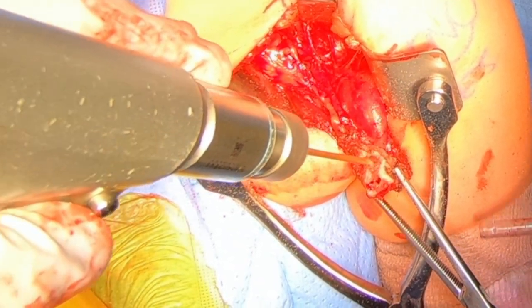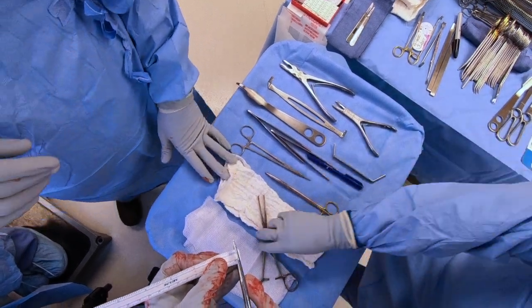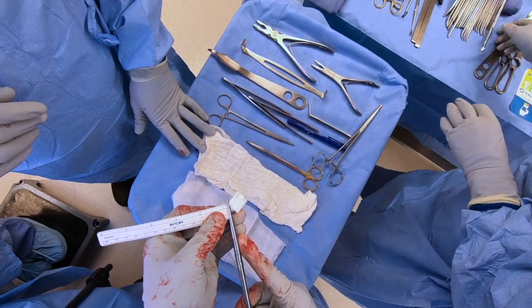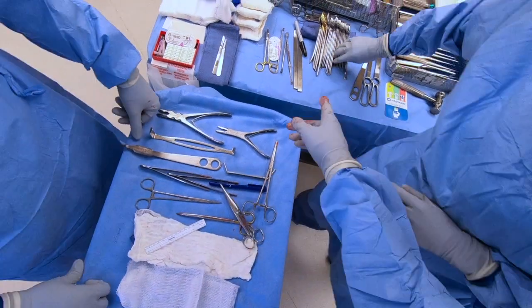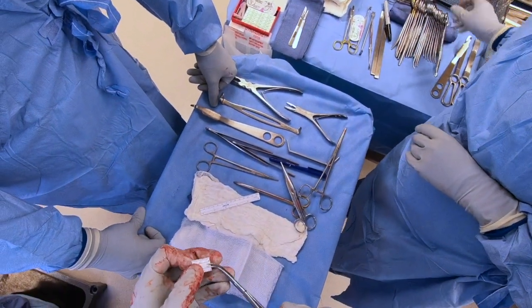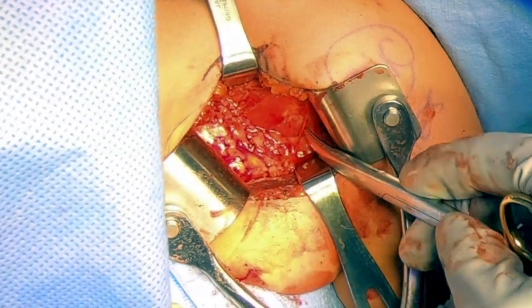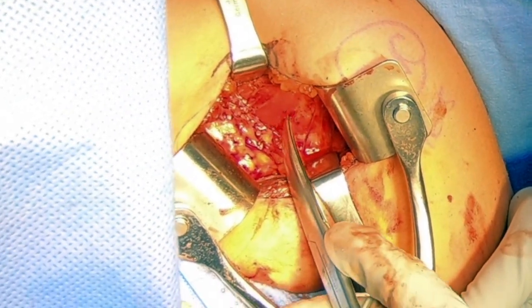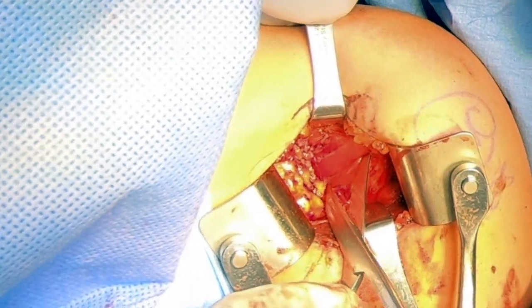Once that's complete, you'll see me using a ruler to measure exactly where those holes are, and then I'll prepare that ruler for later use so that I can measure on the socket to put the screws in exactly the right place, making sure the graft is perfectly lined up with the front edge of the socket. This is a procedure where there's no room for error, so I'm very careful to make sure the screws and the graft are perfectly placed. Here you can see us carefully determining exactly where to make our split in the front rotator cuff muscle, the subscapularis, in the muscular portion.